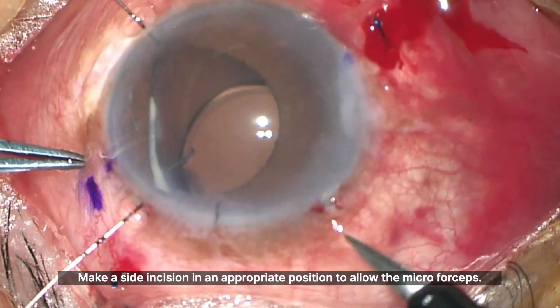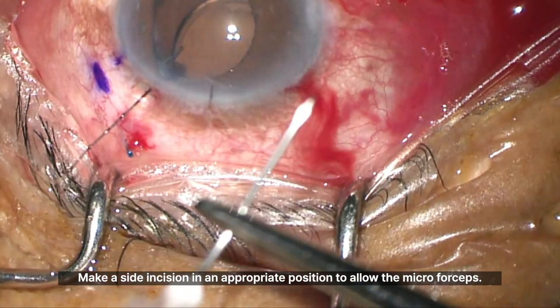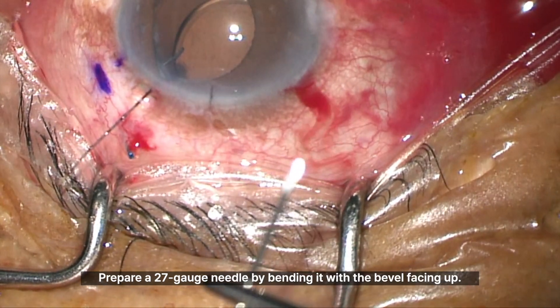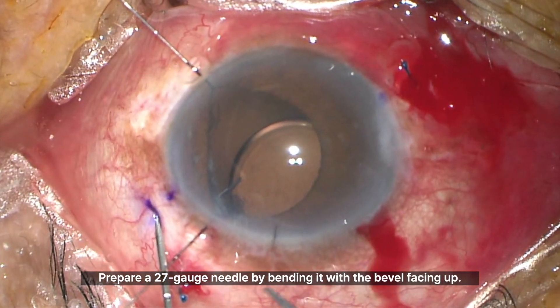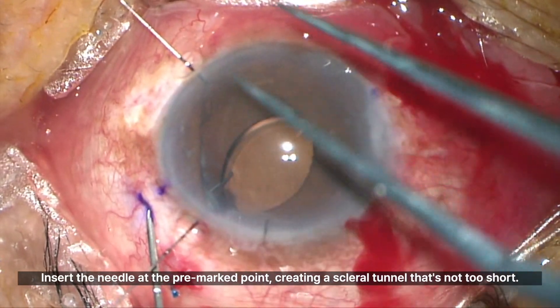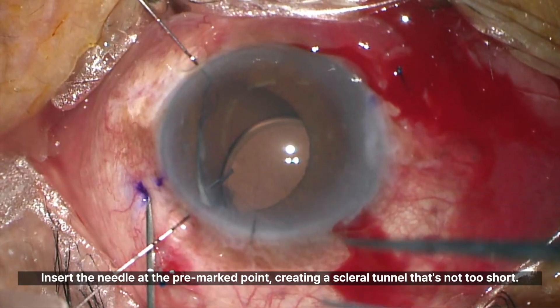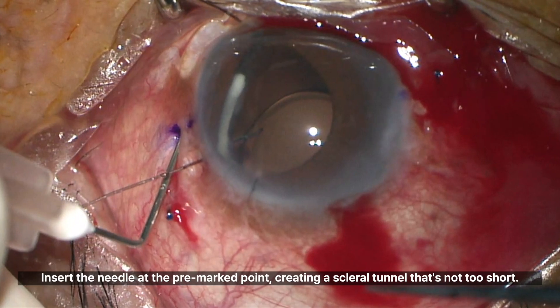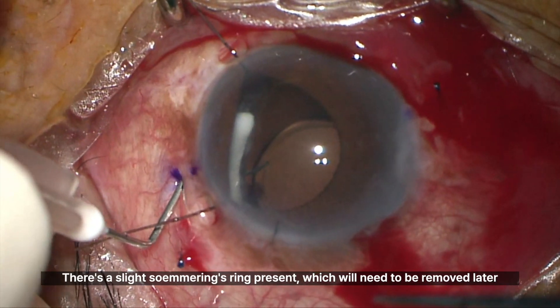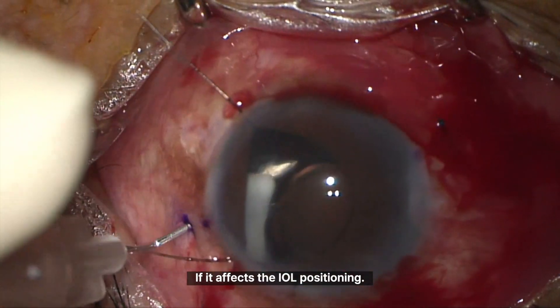Make a side incision in an appropriate position to allow the micro forceps. Prepare a 27 gauge needle by bending it with the bevel facing up. Insert the needle at the pre-marked point, creating a scleral tunnel that's not too short. There's a slight Sommering's ring present, which will need to be removed later if it affects the IOL positioning.